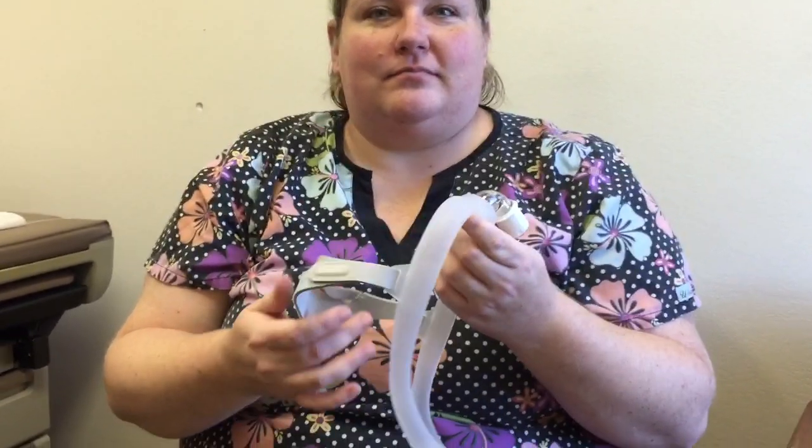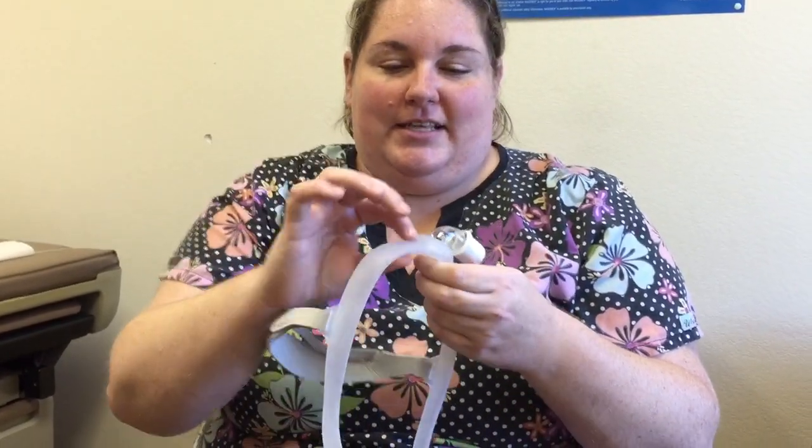Previously, Kim used the Polaro mask, but after several nights it irritated the inside of the nostrils and she had to use Neosporin. This new mask does not irritate, and it doesn't leave marks on the cheeks either. The headgear itself is a tube, which is an interesting design feature.